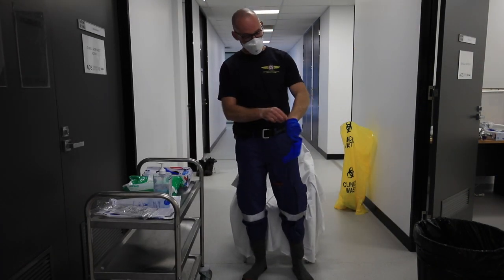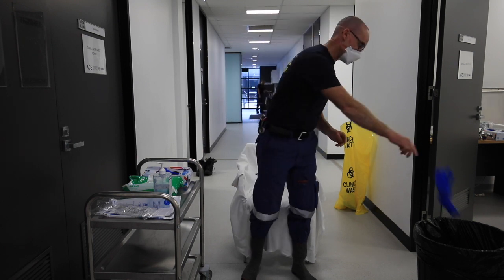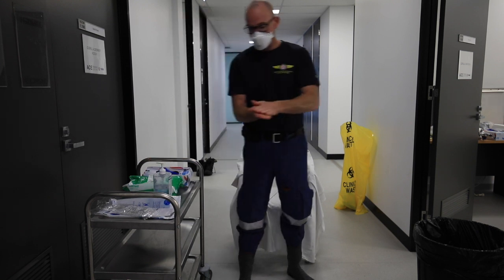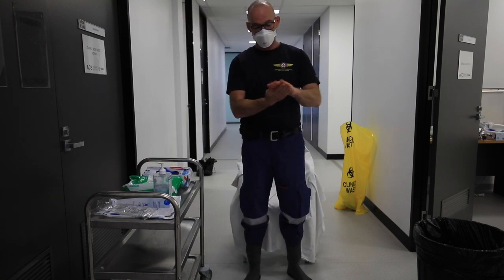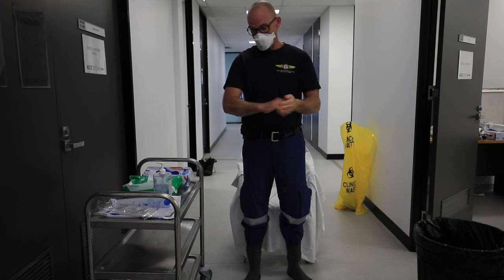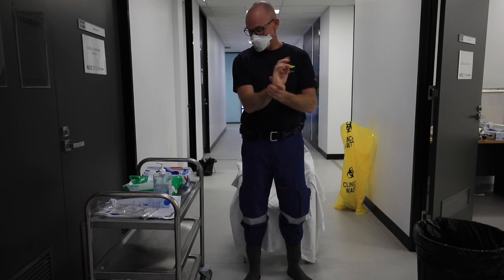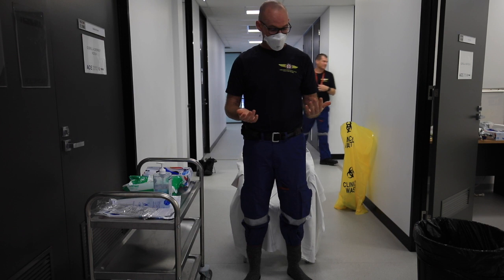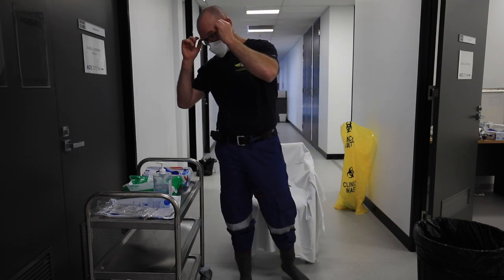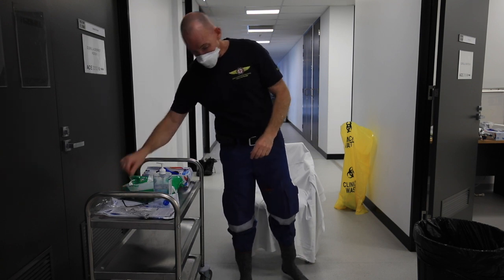Now I'm going to remove the inner gloves, put the contaminated waste in the bin, and perform hand hygiene and wait for that to dry. Once that's dry, remove my eyewear.